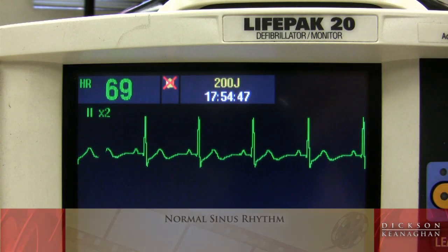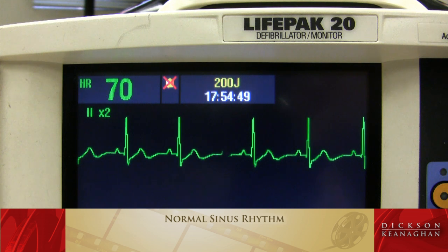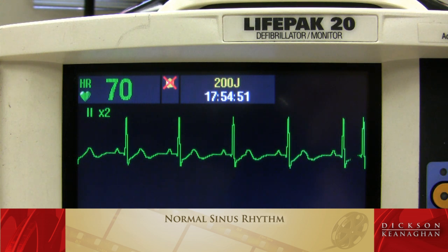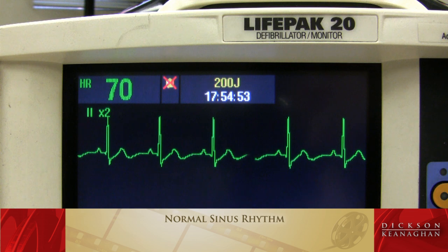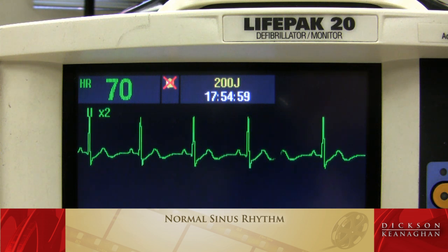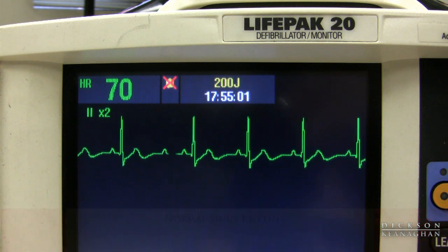Normal sinus rhythm. The heart rate is between 60 and 100. The PR interval measures normal. The QRS is usually narrow. The R2Rs and the P2Ps all measure regular. So normal sinus rhythm, or regular sinus rhythm, is this picture.